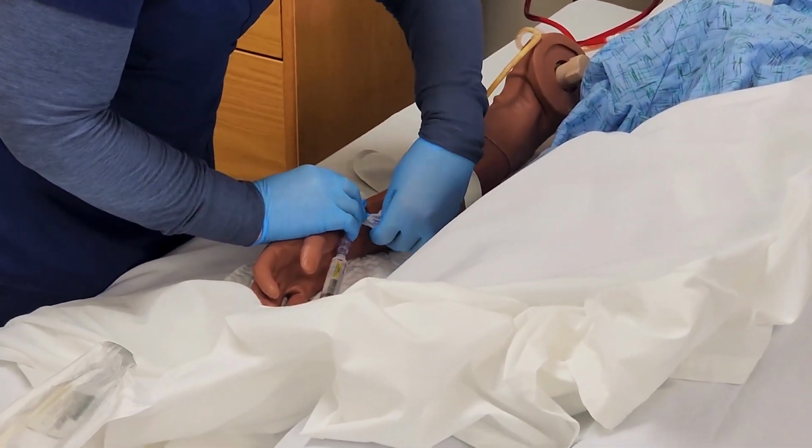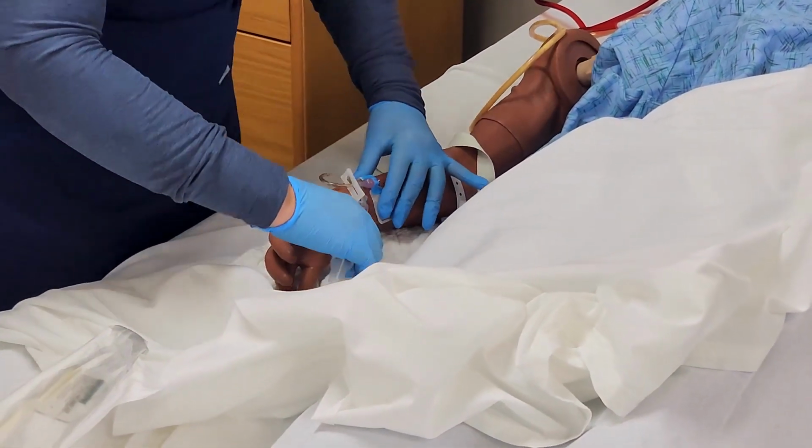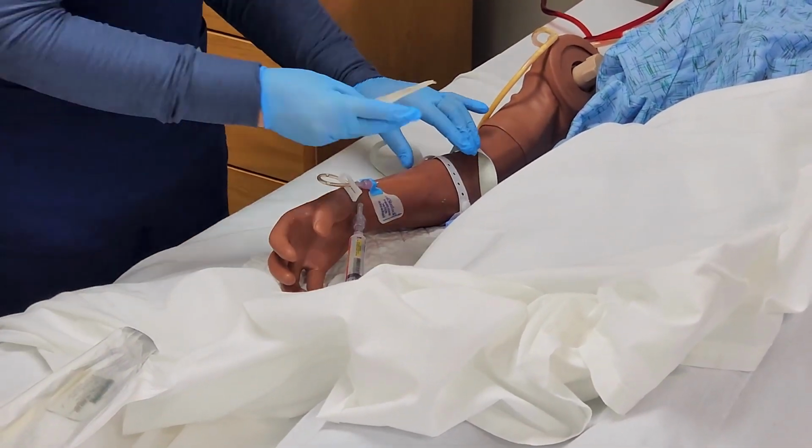And once you have your stat lock secured on there, then you can go ahead and put your Tegaderm dressing, your clear dressing over.